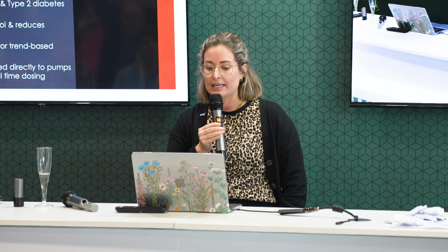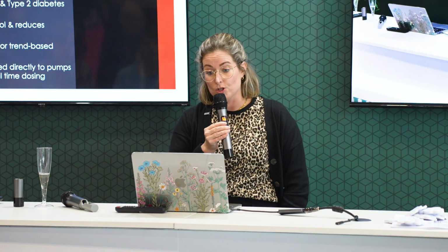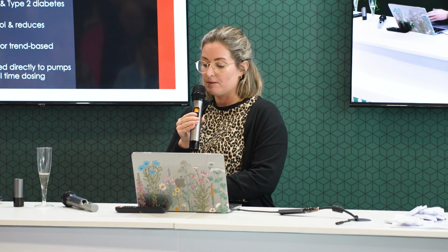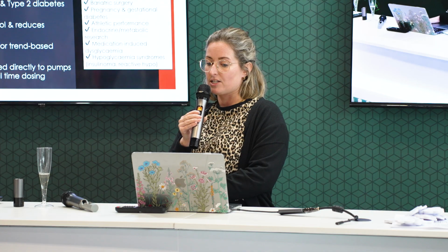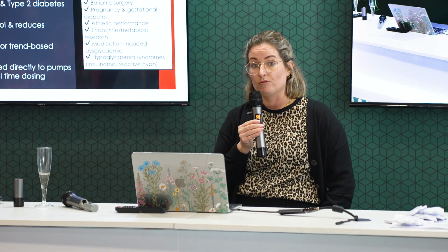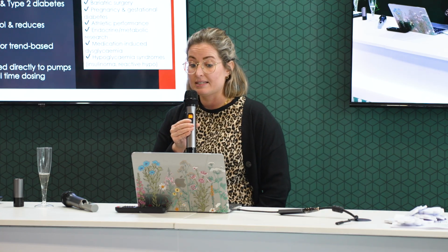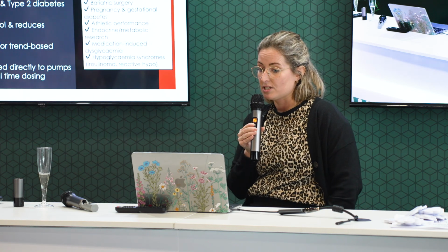And whilst we're here today thinking about the use of these devices in veterinary diabetic patients, it's also useful for us to think about other times when these might be used, and again to reflect on human healthcare. These devices are being used in ICUs and for critical care patients, so particularly thinking about unstable diabetic patients in a hospital setting. They're often used under anesthesia and surgery.